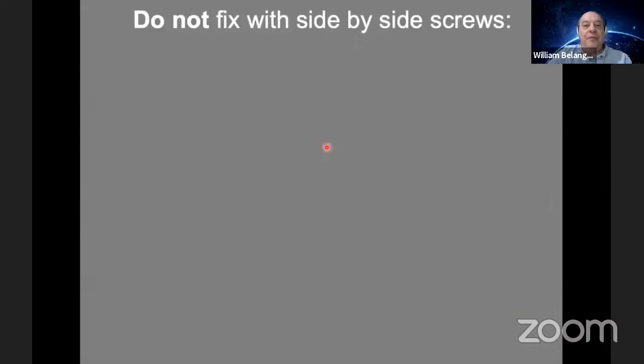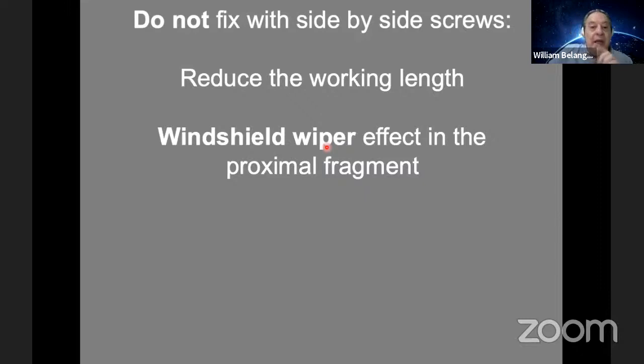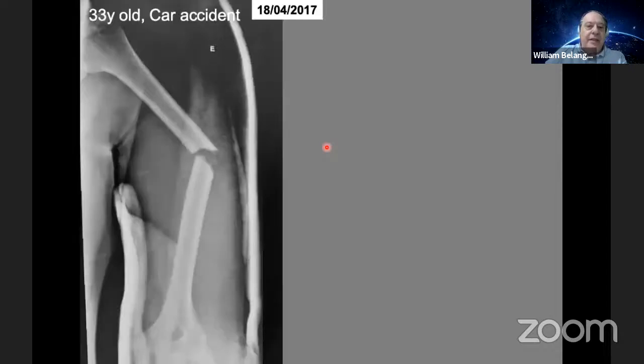Please, attention. I recommend do not fix side-by-side screws, mainly in the proximal fragment. It reduces the working length of the screws and allows this wide windshield wiper movement in the focus with loss of reduction. I show you. For this reason, I recommend to maintain an empty hole between them or to use 3 screws. Let's see one case. This is the case.